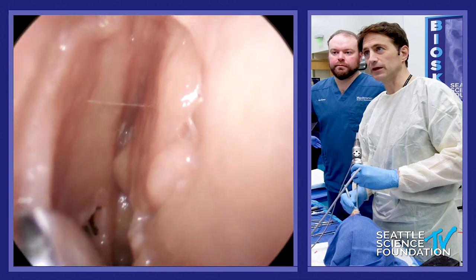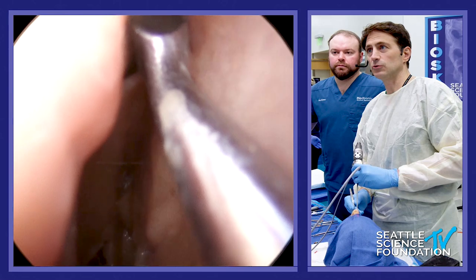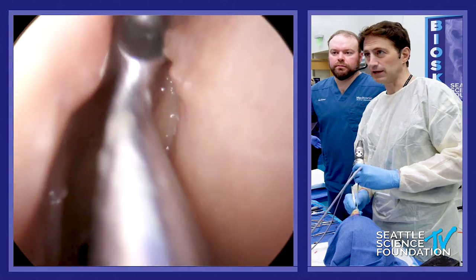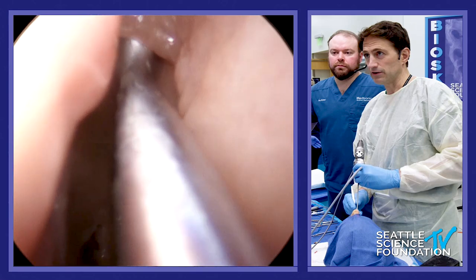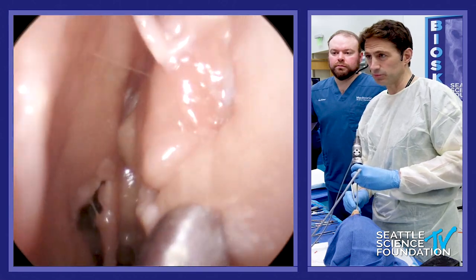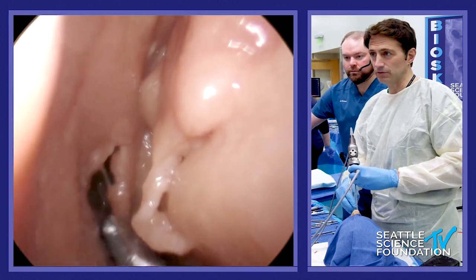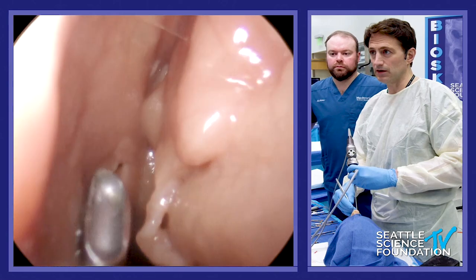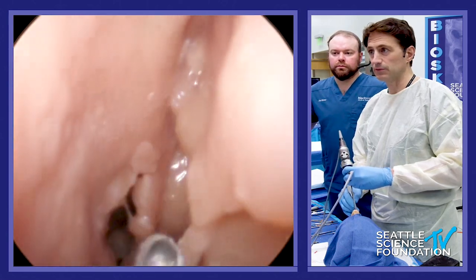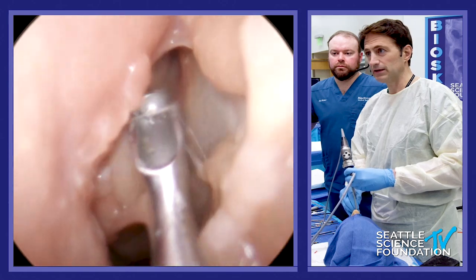You've got to make sure you're staying on the bone there. Up underneath the nasal bones — you don't want to be anterior where the cartilage is, otherwise your cartilage will collapse if it's not covered at the end. I like to just stay underneath the nasal bones. Then the incision comes down to include the upper portion of the septectomy, which is naturally going to occur at the level of the middle turbinate, all the way back about five millimeters behind the middle turbinate.